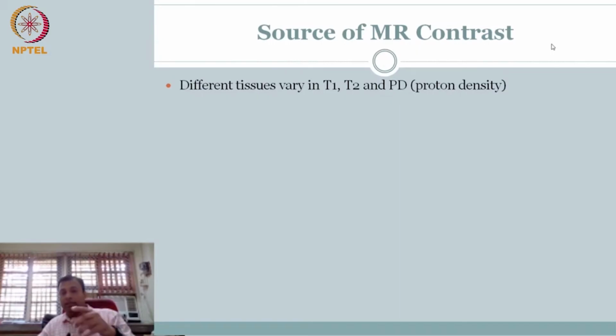Yes. Remember, this is just the physics. Now you have to measure this. So did we have any parameter that is going to control how we are going to measure it? Recall the parameters that we talked about that influence the signal. First thing is, remember that alpha. I have my signal here, but I cannot measure it. I have to push it to the ground, or the transverse component is what I am measuring.